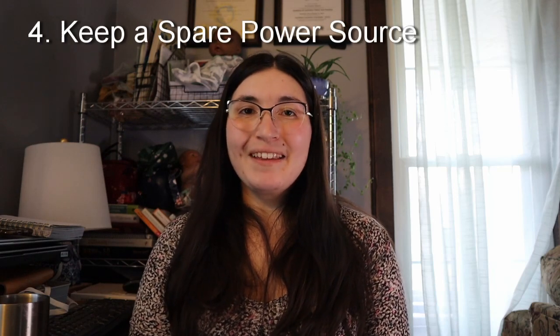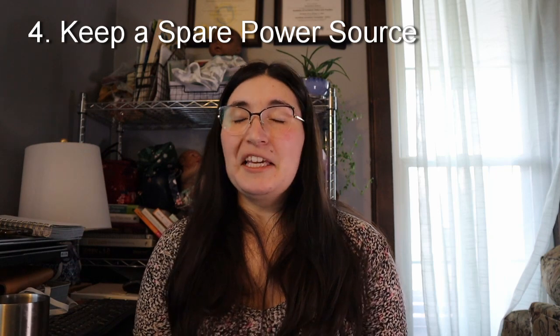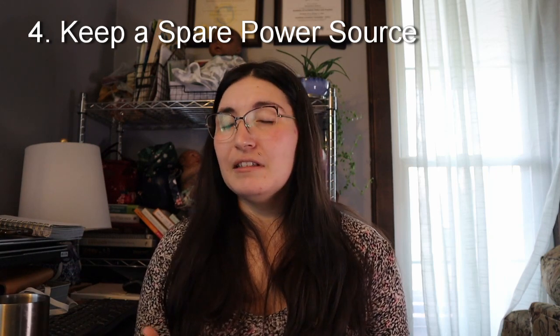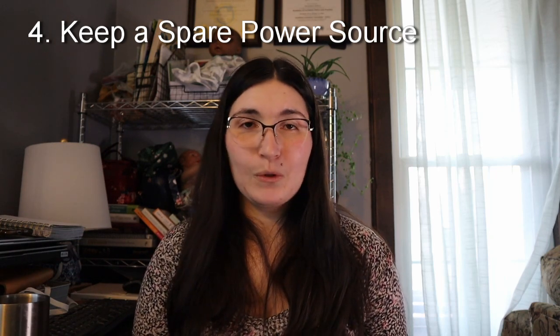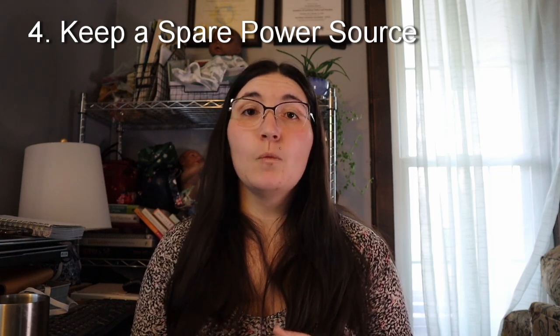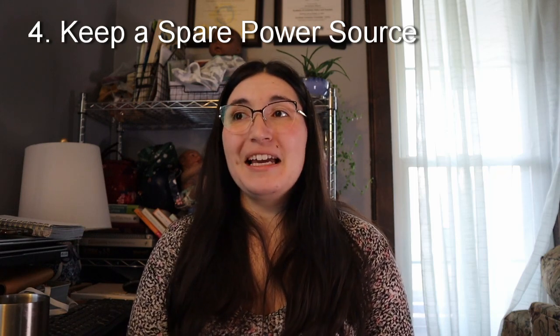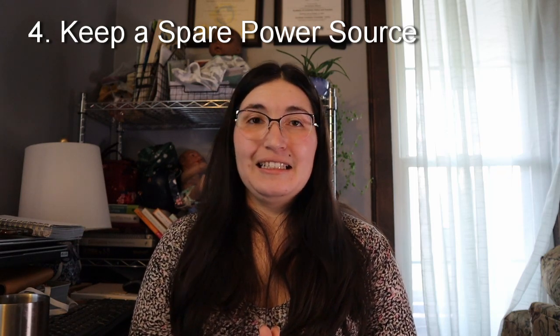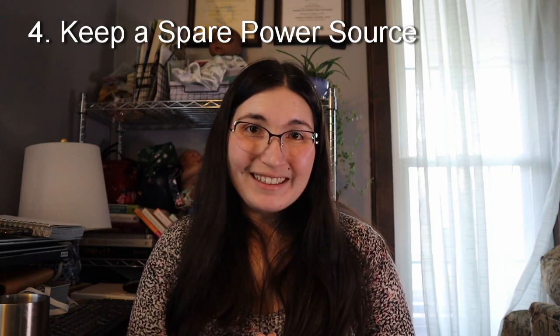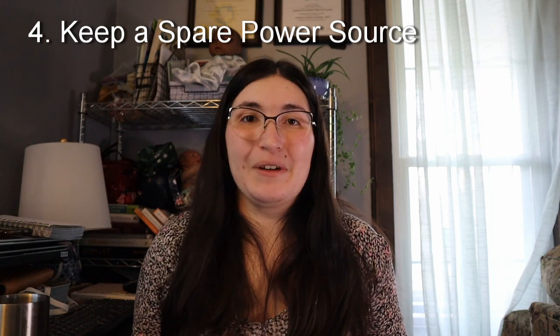Number 4, keep a spare power source. Keep it with you in your car, in your desk, somewhere. Or keep a backup like little battery pack with spare batteries in your pump bag, because you don't want to be without power for your pump, because that kind of completely defeats the point.